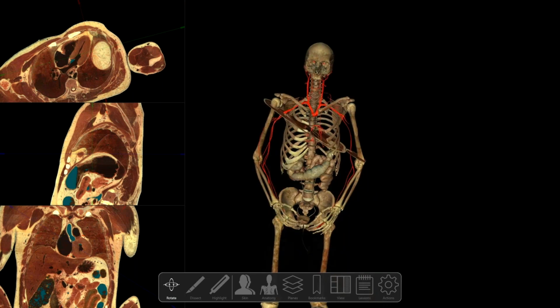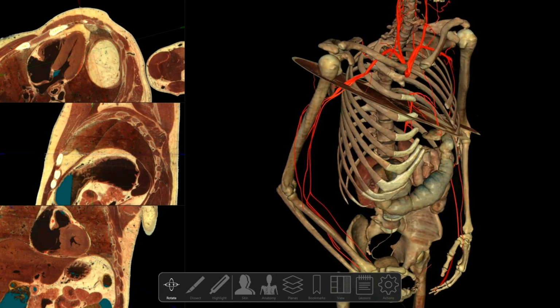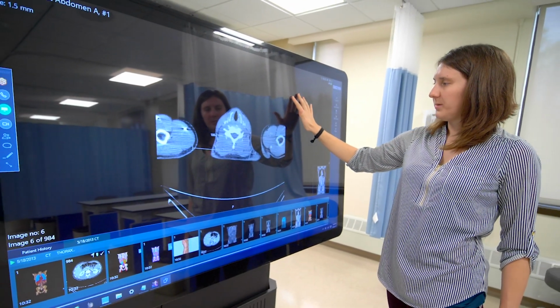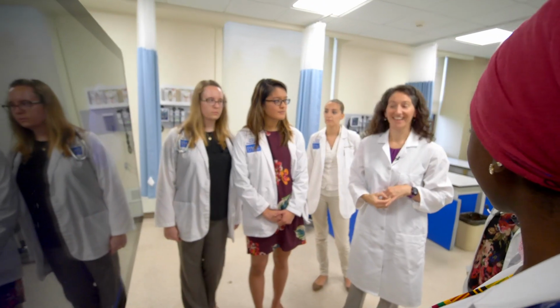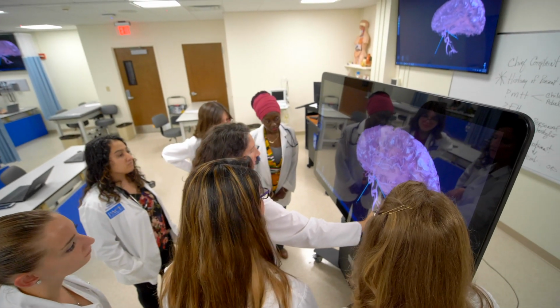As you rotate the cadaver, you get the real sense of the three-dimensional space, which is really what I'm looking for as the students interact with the machine. We also offer the education portal, which are actual CT scans and MR scans and other DICOM image data sets of actual patients. This offers the opportunity for students to integrate what they learn in anatomy with clinical scenarios so that they're getting the same experience that they might in medical school or as a professional.